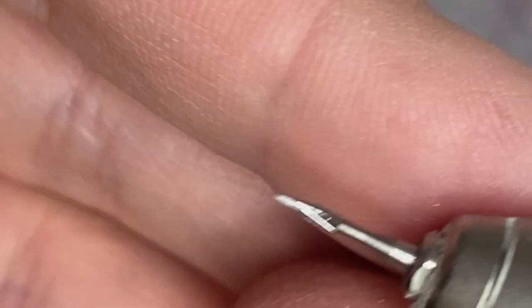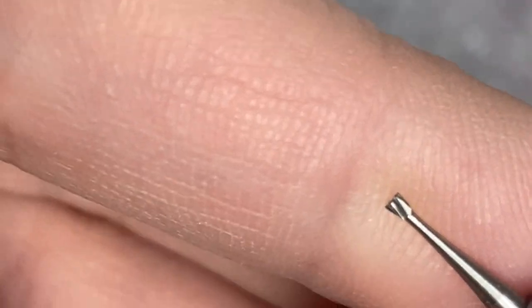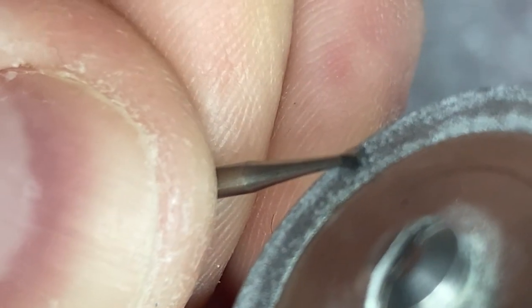It actually works as well as a regular needle burr. As you can see, it rotates nice and straight. You can do the same thing with this other burr — it doesn't matter if it's new or old. Just remember that you hold the burr and rotate the disk.